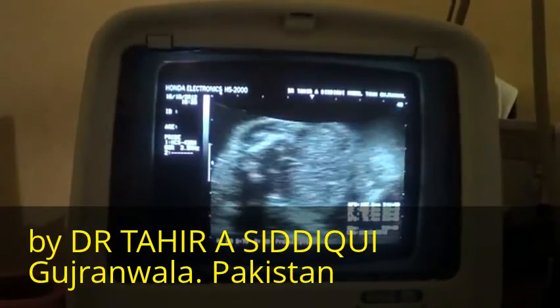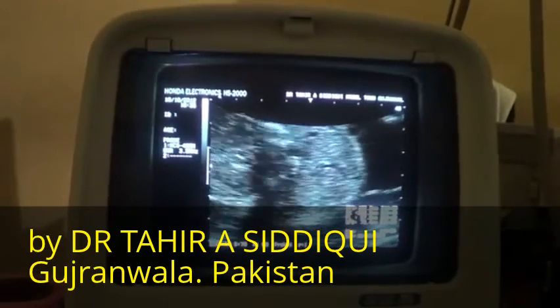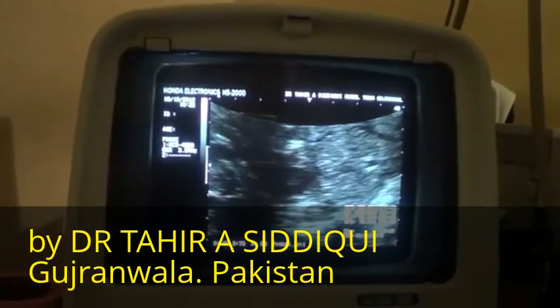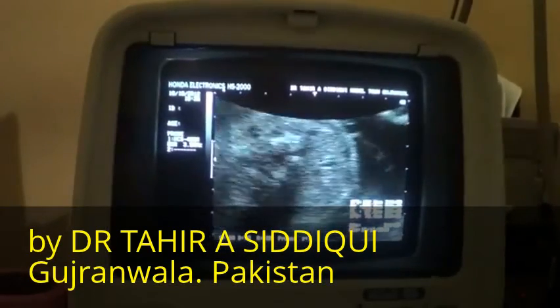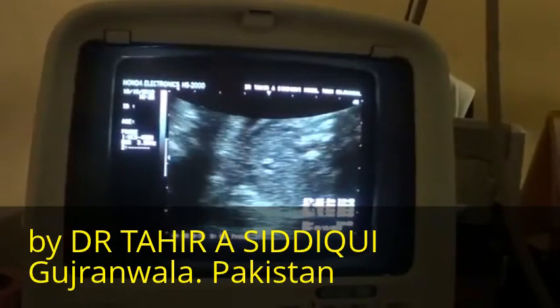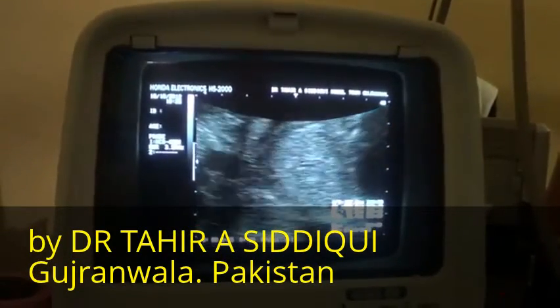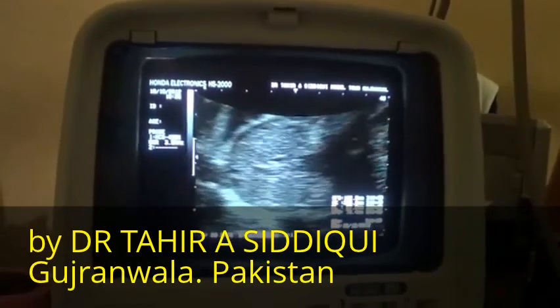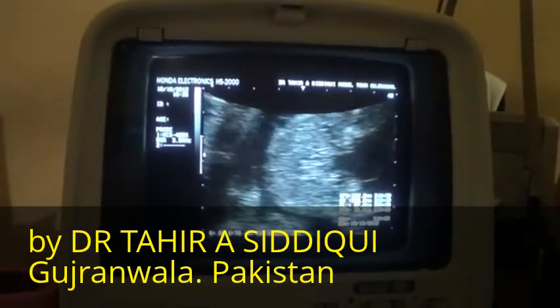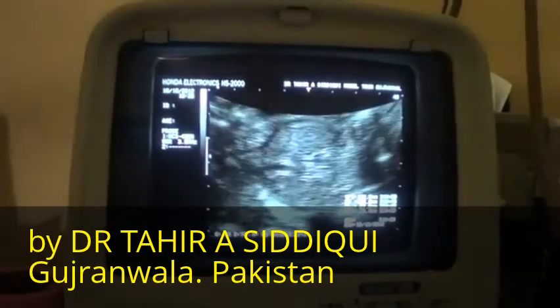I am giving a full sweep to the mass to see if it changes its shape or it remains the same. There we are. Typical ultrasound scan to perform.